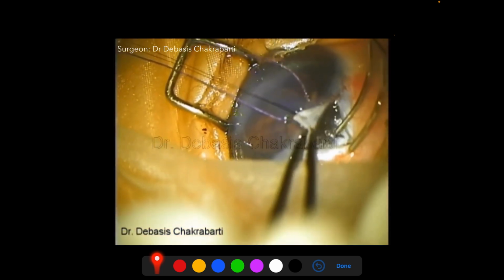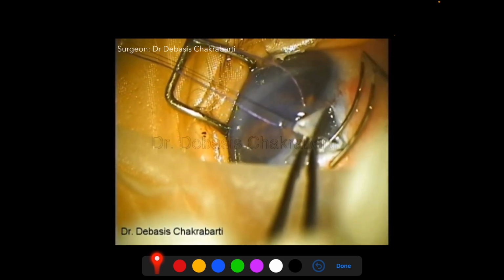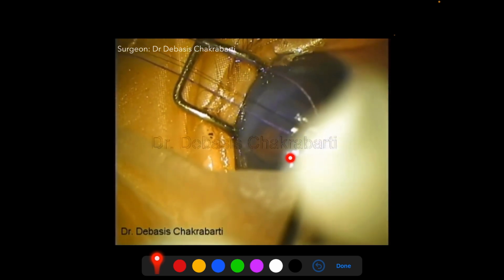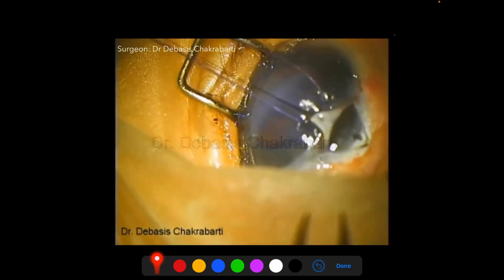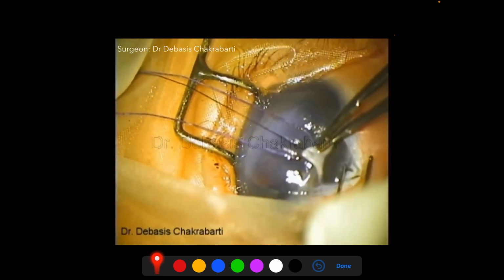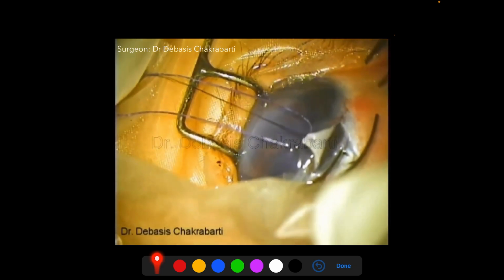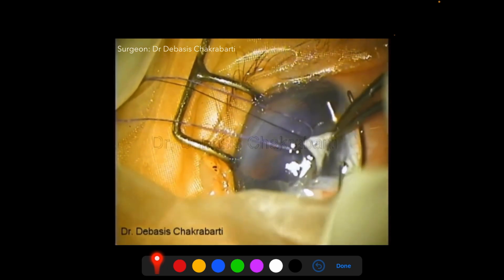Then the distal arm of the left Harms trabeculotome is introduced into the Schlemm's canal and rotated inward, following which the distal arm of the right Harms trabeculotome is introduced into the right side inside the Schlemm's canal and is rotated inward.